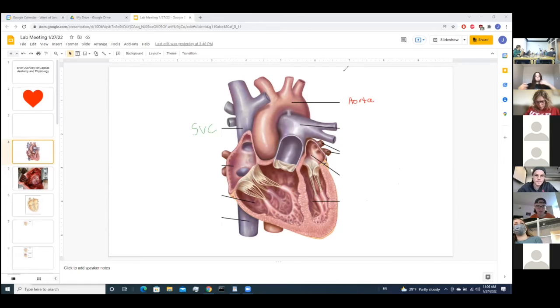Who's next? Okay, so right ventricle. Okay, so what part of this are you saying is the right ventricle? Is it that black line? Yeah, the right, top part. Okay. So if I was to draw a circle around the right ventricle, what would it entail? Like what parts would it cut off? So is this right ventricle? No, so the ventricle is going to be like around this area. Yeah. Okay. Good.